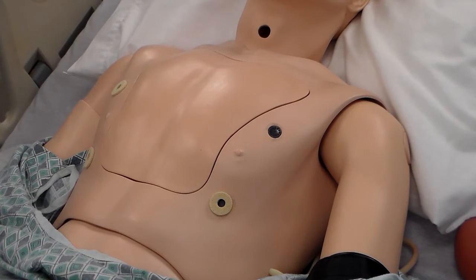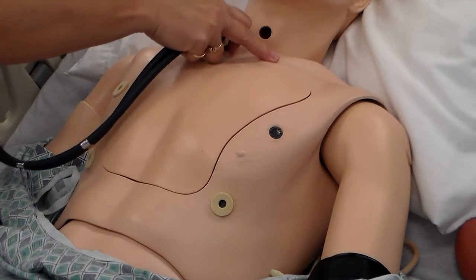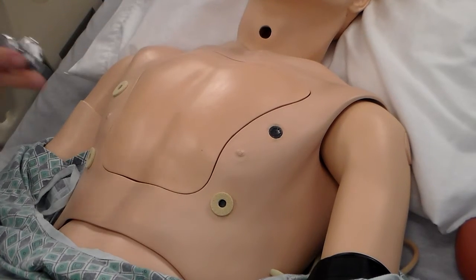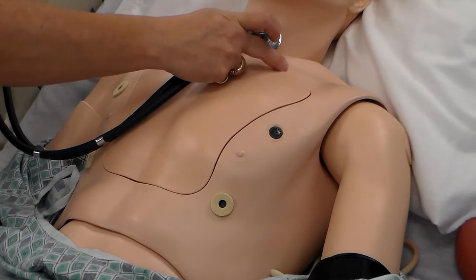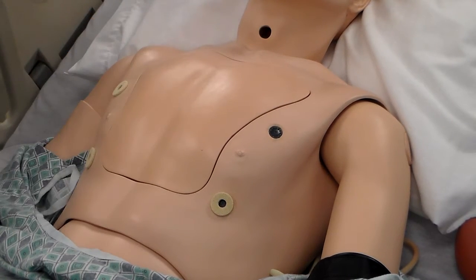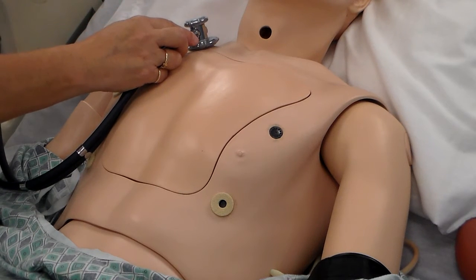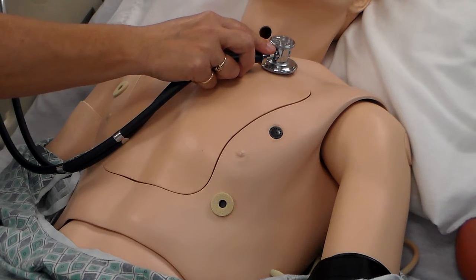So, to auscultate, or to listen to the front of the chest or the front of the lungs, you want to start at the top of the chest, okay? And what you want to do is you want to listen in the same location but on each side, okay? What do I mean by that? You're going to start with 1 at the top, 2, okay?